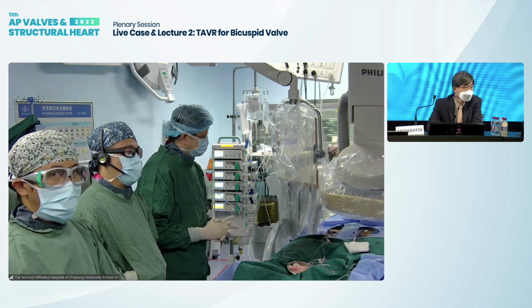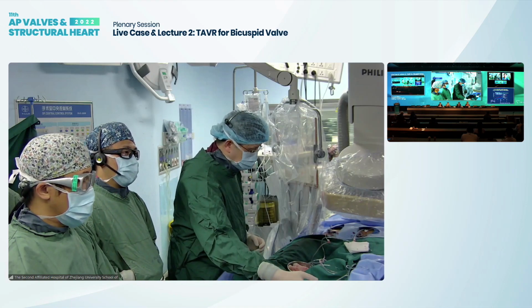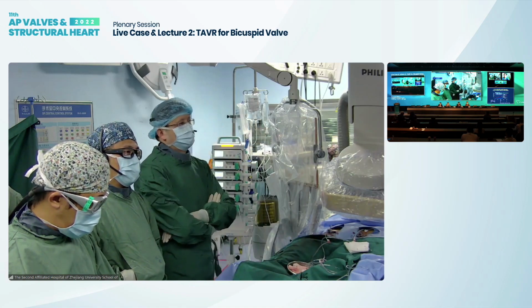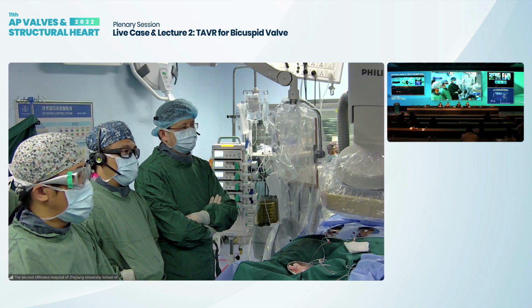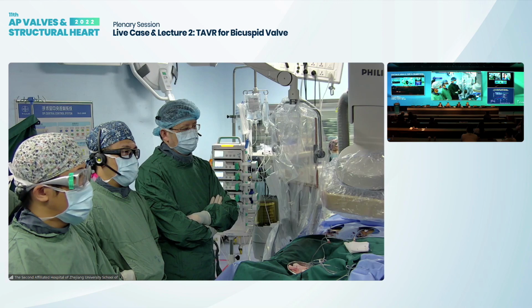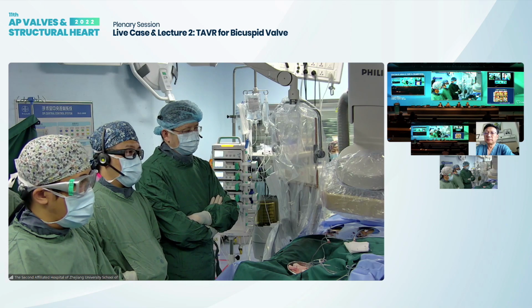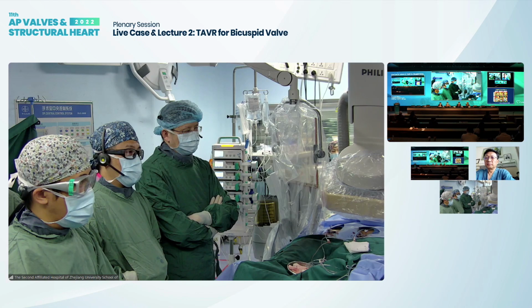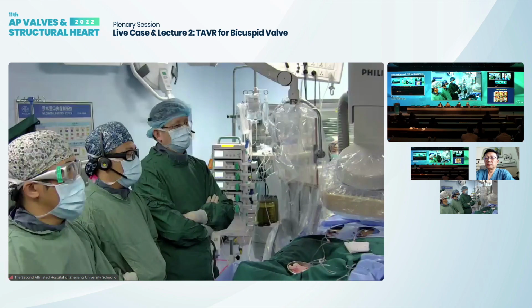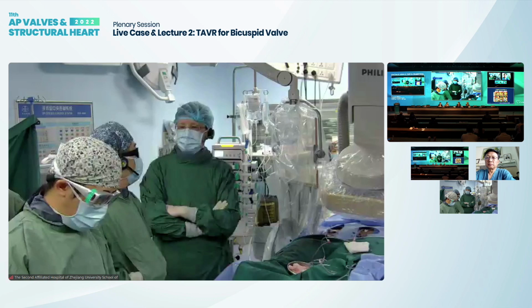Sure. So one quick question, Doctor. You said you have greater strength in the Venus A valve. Do you know by how much? Is it 25%, 50% in terms of the ability to distend the valve, the nitinol frame? I think you cut off again. I think that would be interesting. How much indeed, 10%, 20%, 50%, I don't know.